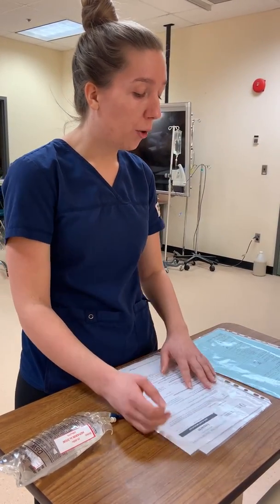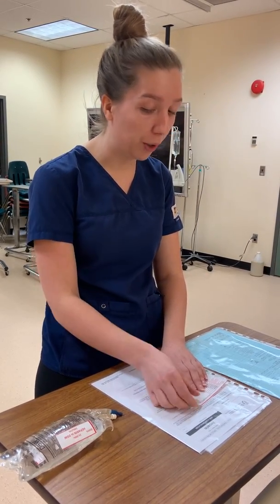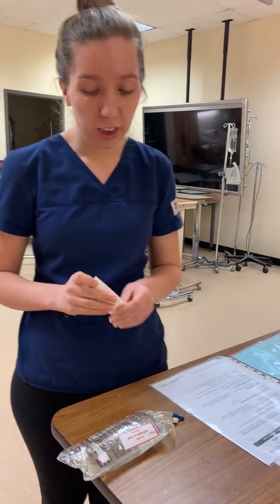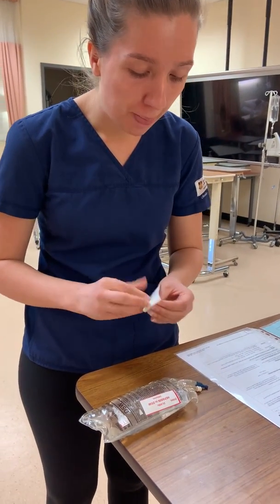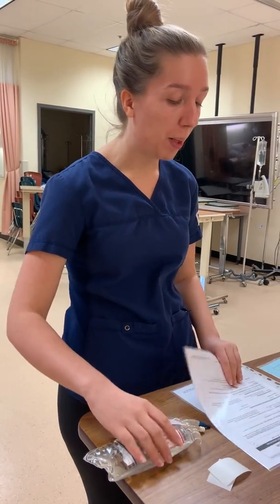I also indicated the prescribed rate, or this prescribed dose for my patient, which is 1350 units an hour. Now at this point I can attach it to my bag, and I would now call in a second nurse to do an independent second check. They've done so, they've confirmed that I have pulled the right medication and labeled it correctly, and now I can complete my second check.